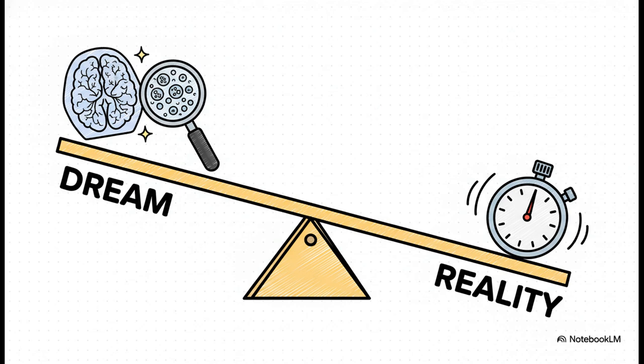And this really lays it all out. On one hand, you've got the dream. Max out the image quality, what we call the signal-to-noise ratio, or SNR, and get every tiny bit of detail, which is resolution. But then, there's reality. And reality says every second counts, so you've got to make that scan time as short as possible. And here's the kicker. These two goals are basically fighting each other.